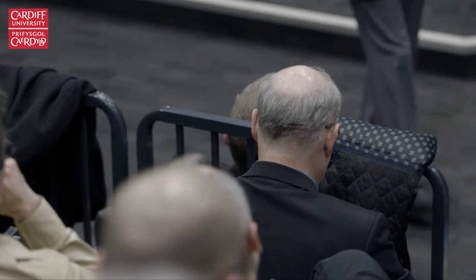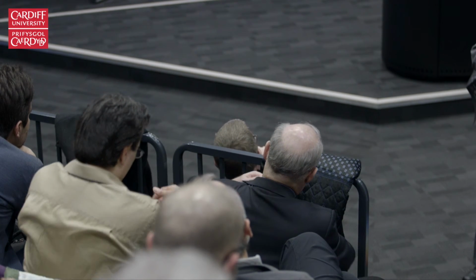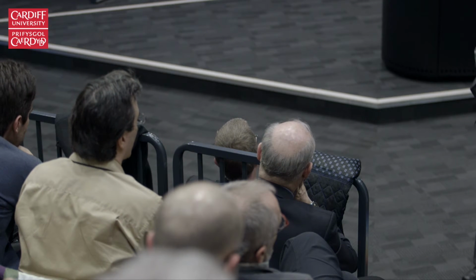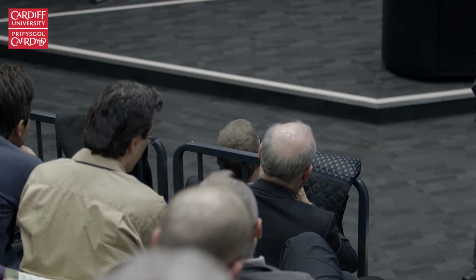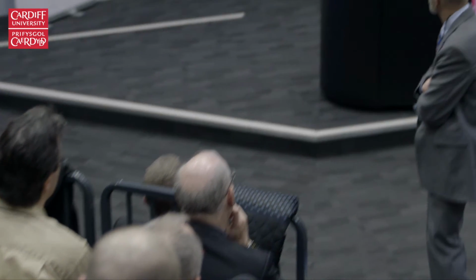So the point of the microstructural FA is it takes out the variation in orientation. But I was just sitting thinking, what about variation in microstructural anisotropy within the voxel? So you imagine you have your rice grains that all have different anisotropy. I think that should be retained. So just what is related to the orientation distribution should be removed, ideally. Right. But of course, you only get one number out. You don't get a distribution of micro FA.